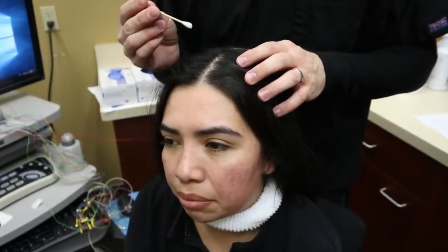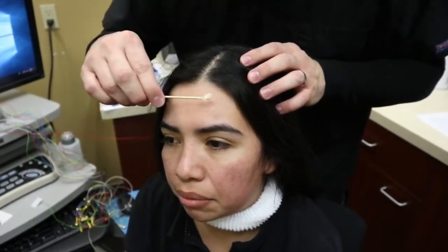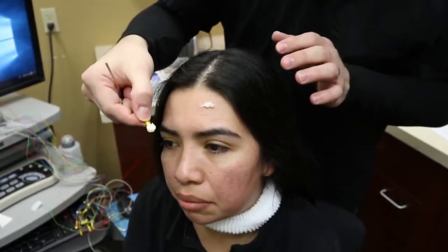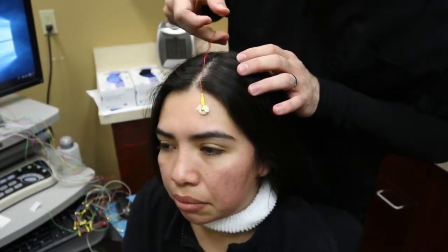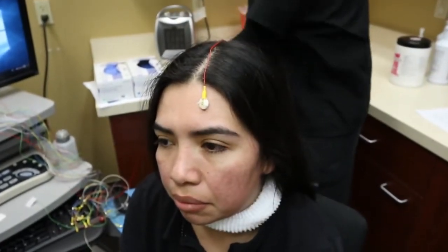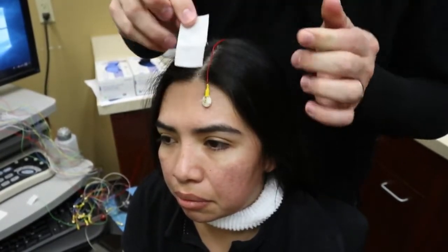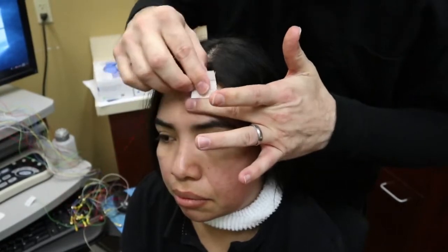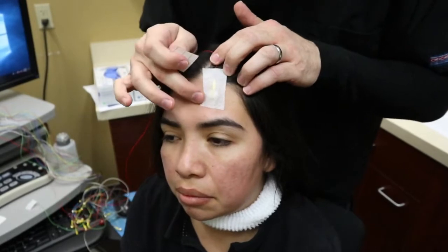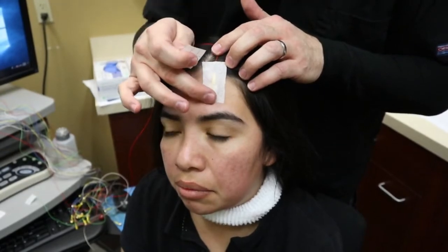I'm going to show you how I do my electrodes. First, I'm going to scrub the spot with the Nuprep. Then place a bead of paste in the spot. Then I'll take my electrode with some more paste and push it on there. Then I'm going to squeeze any extra paste back onto the electrode itself. Then I'm going to take my tape, take off half of the back, place it right in the front, and just pull it straight back. When you place your tape, don't put too much in front of the electrode — the tape does its best work when it's covering more wire than in the front.